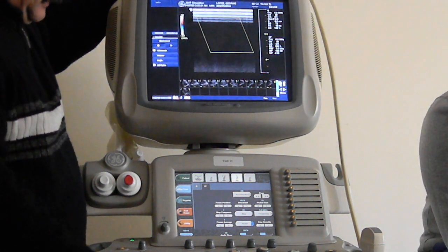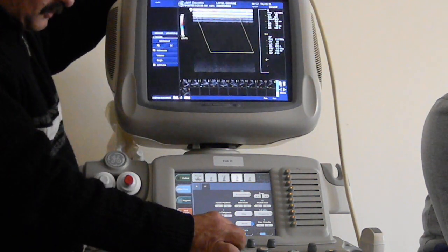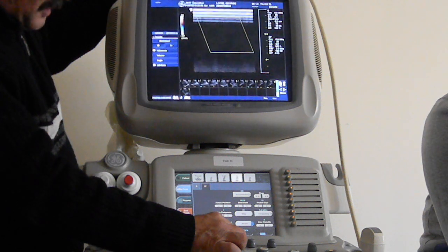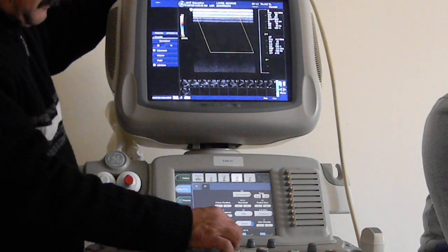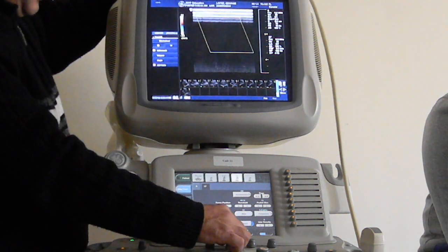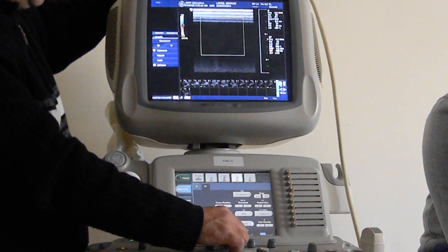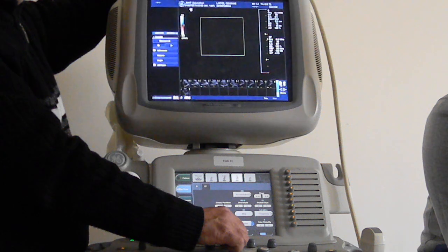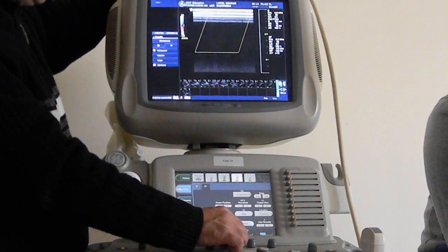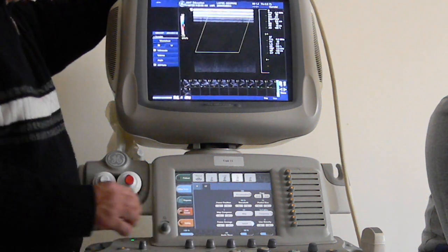This box can be steered, because we have a knob here that says angle steer. It doesn't really matter whether you go clockwise or anti-clockwise; it's going to be the same change.